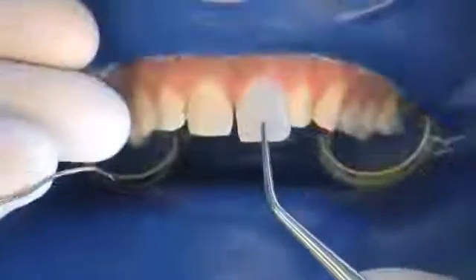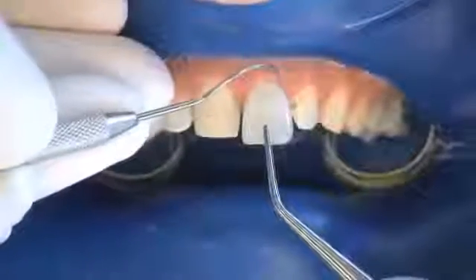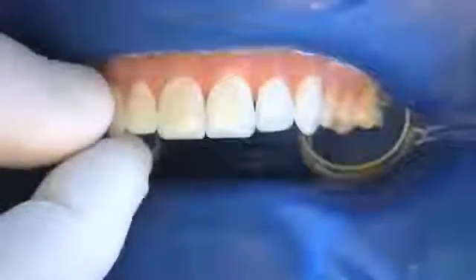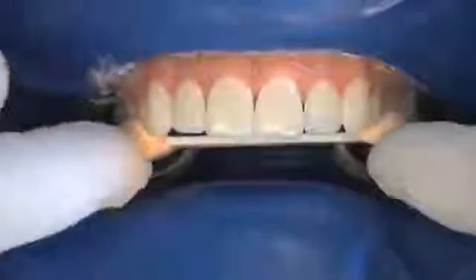Shapes are corrected if necessary by using a low RPM disc operated in a dry oral environment. The COMPONEER holder provides a perfect hold for this procedure. Corrections of shape for cervical contour and incisal length can now be checked directly on the tooth. The corrected COMPONEERs can also be placed on the teeth using a small portion of composite. This makes it possible to check the future occlusal plane.